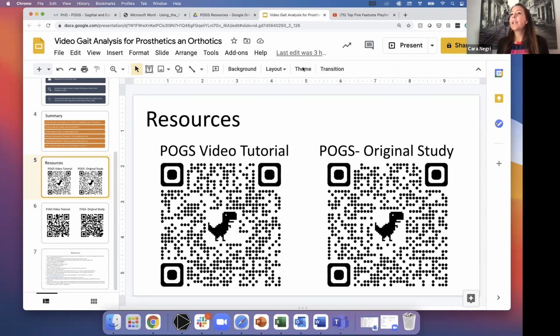Another challenge for people is if the equipment is in the cupboard and you're at an hour and 45 minutes into your initial evaluation, it's very easy to say, I'm just not going to do it right now. So I would say, plan for your initial evaluation, get all your tools available, get the video equipment out, have it set up, those types of little efficient processes of getting the setup right. But there's not a lot of barriers.